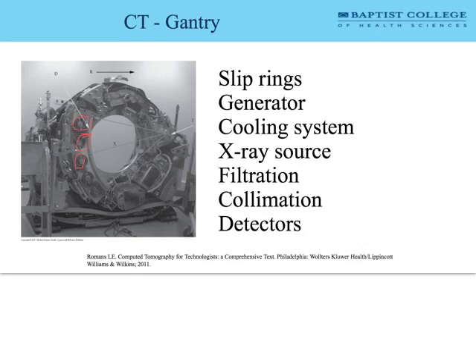Okay? So sometimes we have filters that we add to certain scan protocols, and the bow tie is a good example of one. And the way that I think about the bow tie filter, y'all remember I had it on that little box, right? We had a little box that we used when we built the CT scanner. It had a little bow tie stuck to the top of it. Parts of the human body are basically like a hot dog, right? For example, everyone pretty much has a hot dog head. Our heads are more or less tubular shaped. They're more or less basketball shaped, right?